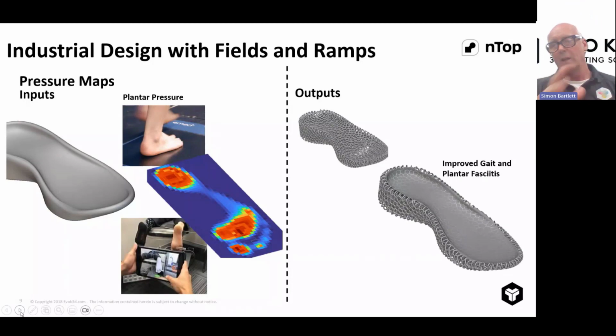And then not only that, we can add the biometric data from the patient too. And so any of the clinician's inputs, we can also drive that design as well. So it's actually doing two functions. Not only can we improve the gait, but we can also improve on the form and fit to the patient as well.